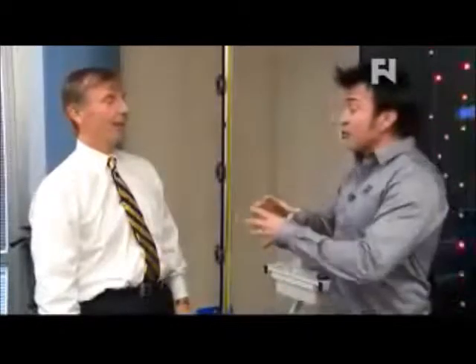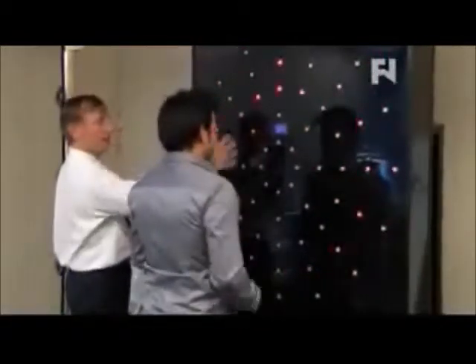It's the recognition that a punch is coming at a player or a fighter that they have to react to. And so this thing is going to measure how quickly I do that now, and through a series of challenges over weeks and months and maybe years, you're going to teach my brain to make that action happen quicker. Right. So you're going to be staring straight at that screen in the center. Right hand does the right side of the board, left does left. So you're going to be in your fighting position, so you know where you're going to react to. We like to make it sport specific, so in your fighting mode. Okay?